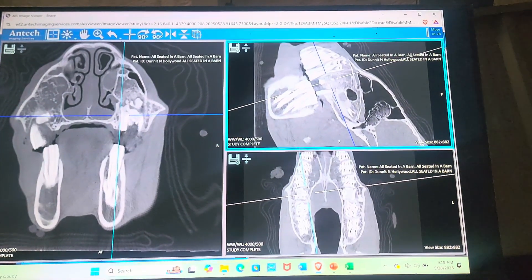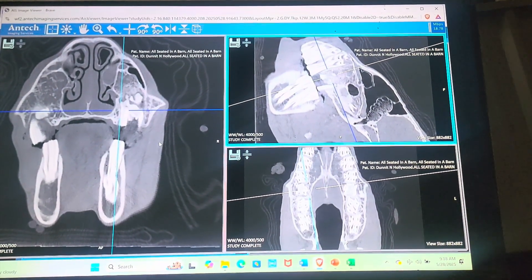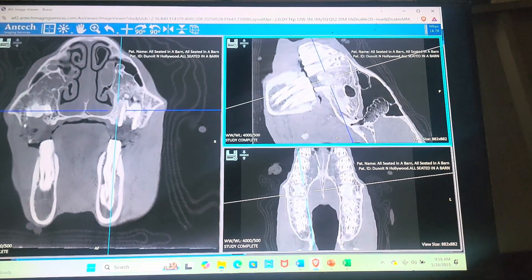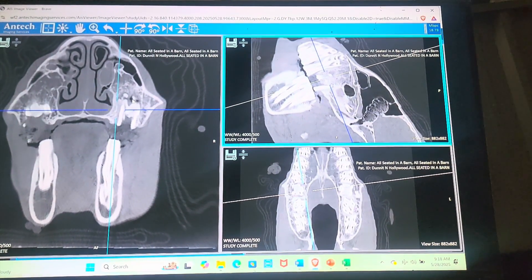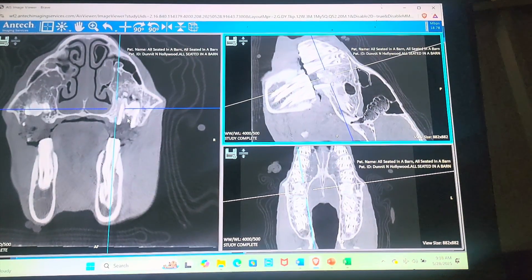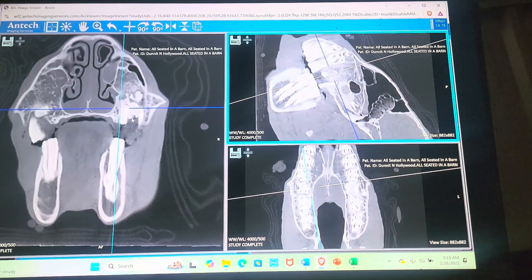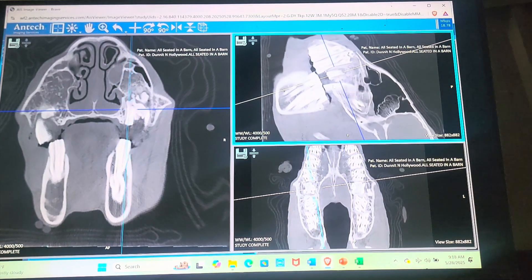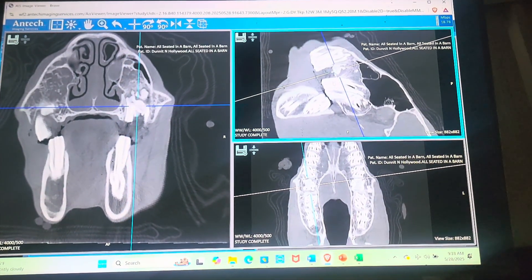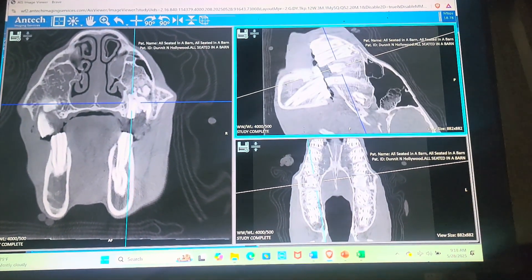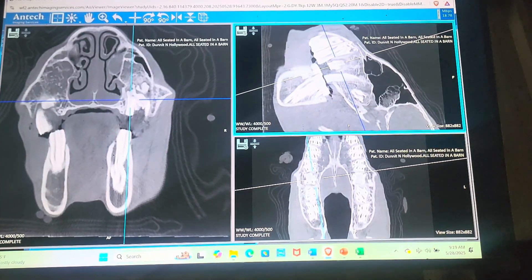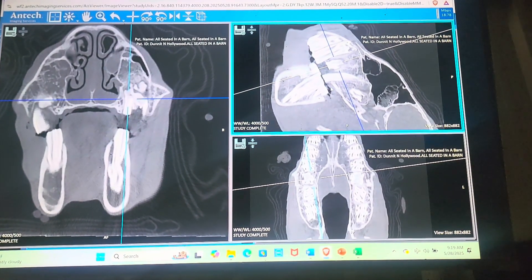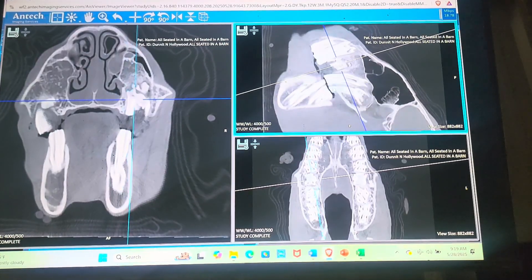Now let's go over to the right side — the 109. We'll make a couple of adjustments to our configuration and change some of the angles. We can see the 109 is also fractured and very hollow, with some infection around it. We really don't have any clinical crown to work with during surgery either, so this is definitely a challenging case.